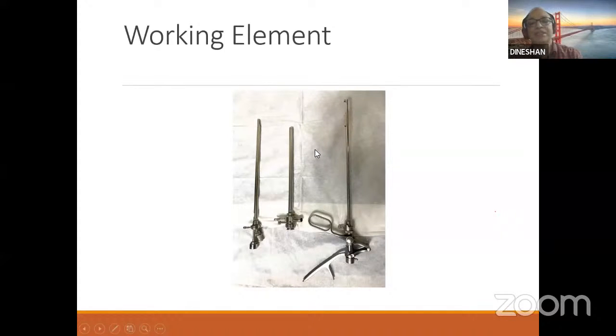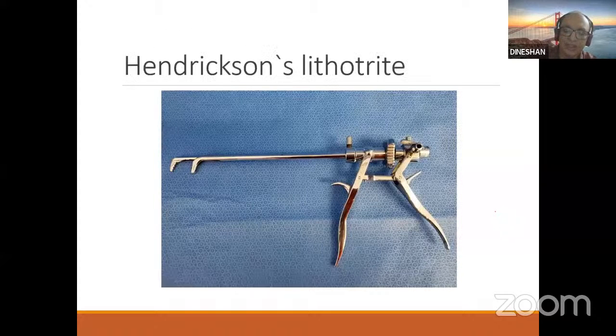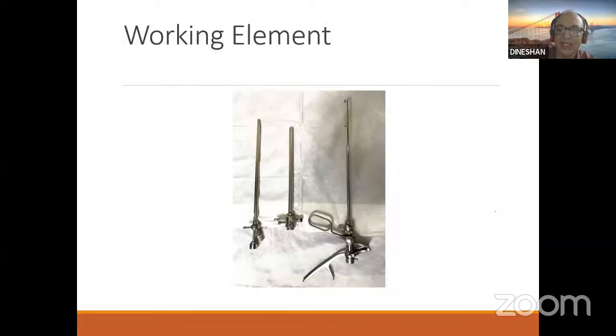To ensure that, the best thing is you hold the stone first, elevate the tip while holding the stone, and rotate the handle by 90 degrees, so that you are sure that you have not caught the mucosa before you crush. Make sure that the mucosa is not caught in between. Otherwise, chance of injuring the mucosa is very high. Before you put it inside, always make sure that the bladder is filled.